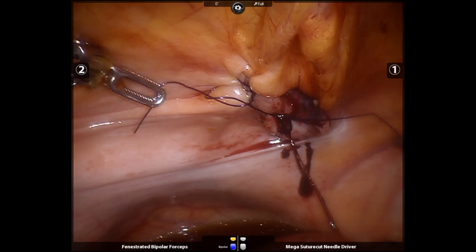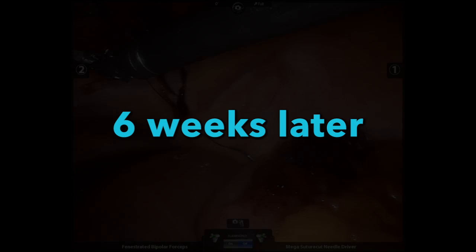Six weeks later, the patient was consented for definitive repair. Here was the site of the temporary patch.